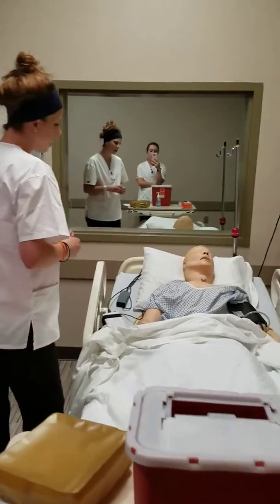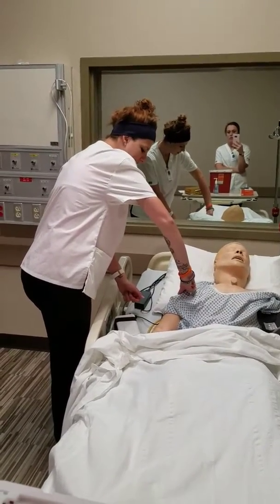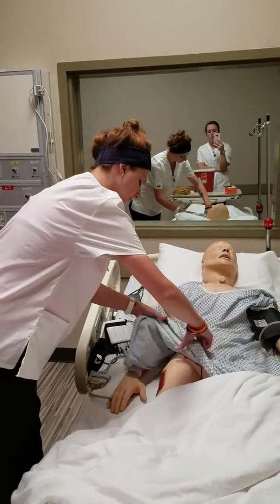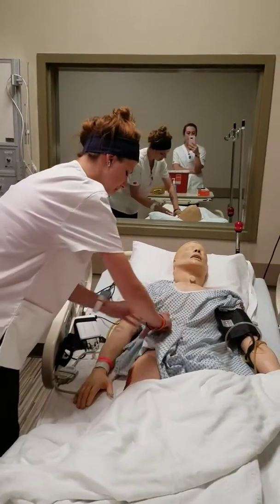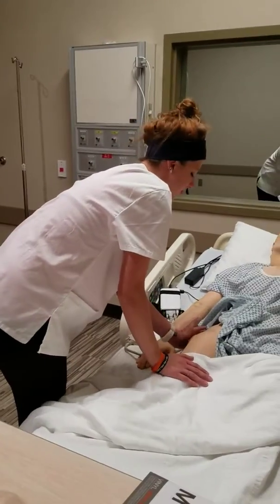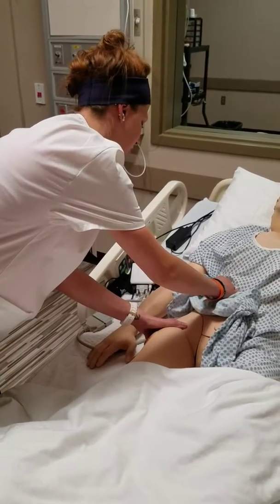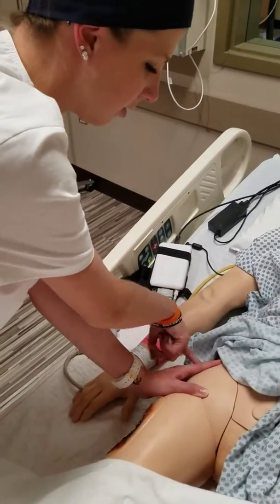With intramuscular injections, you can give it either three fingers from the acromion process, but we usually don't do that in the deltoid for elderly patients. Another place you can go is the vastus lateralis, or what we're going to do today — I'm going to place my hand on the side of the hip, face my thumb towards the groin and my index finger towards the spine, and give it right in between the two fingers.